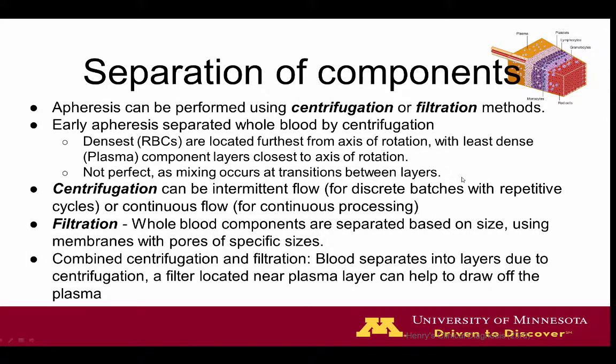So, as I mentioned, centrifugation or filtration can be the method to achieve this separation. The earliest apheresis equipment involves centrifugation, and the idea is that with a spinning force, the most dense components, in this case the cellular components, are typically furthest away from the axis of rotation, whereas the less dense components are closer to the axis of rotation.